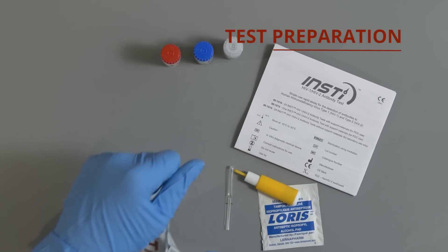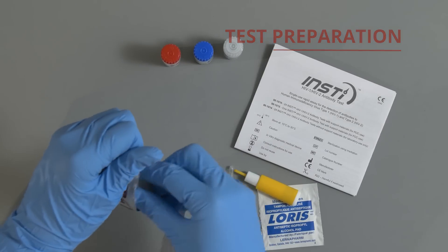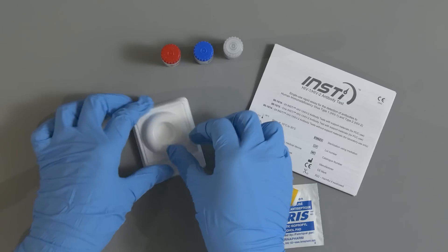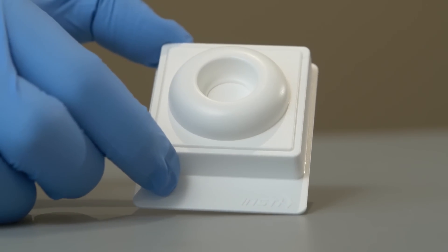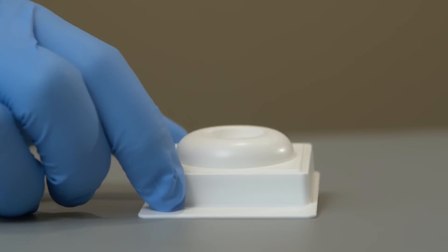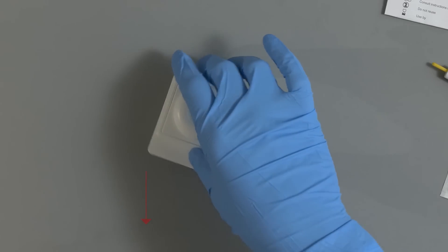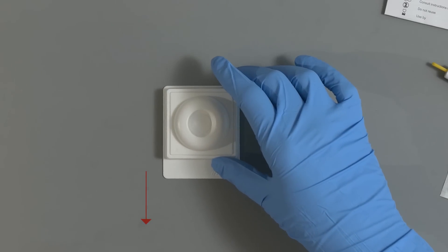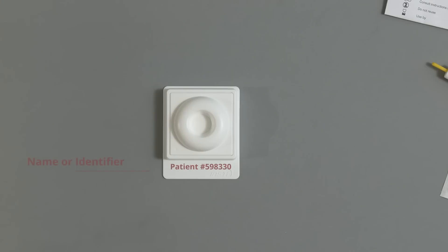Tear open the membrane unit pouch at the pre-cut edge and carefully remove the membrane unit without touching the centre well. Place the membrane unit on a level surface. Make sure the tab of the membrane unit is oriented towards you. For sample identification purposes, the tab may be labeled with the patient's name or identifier.